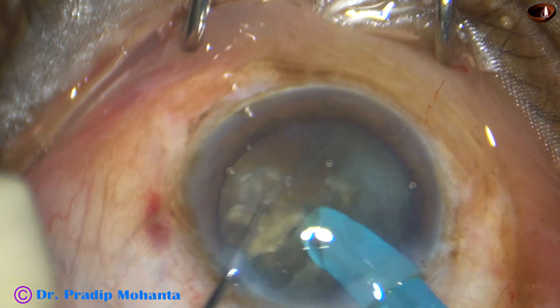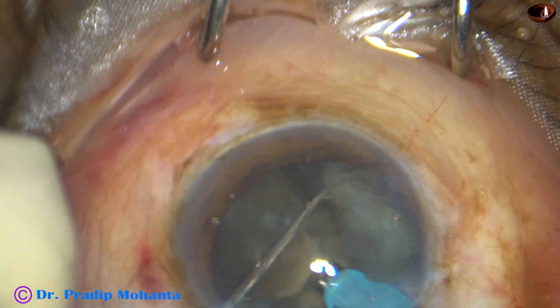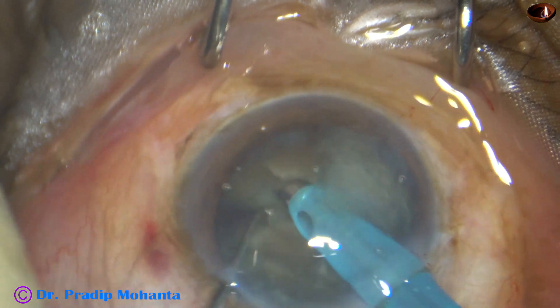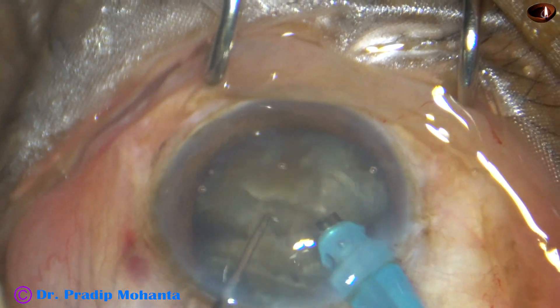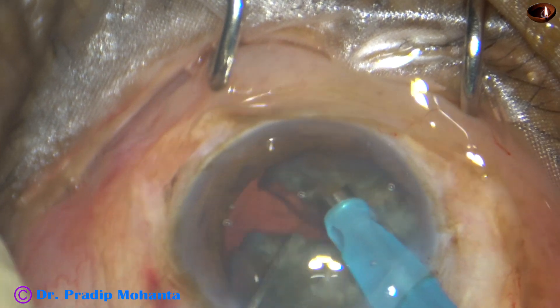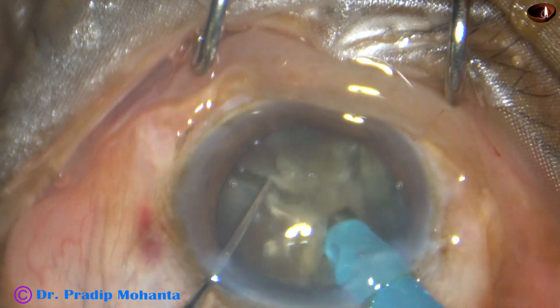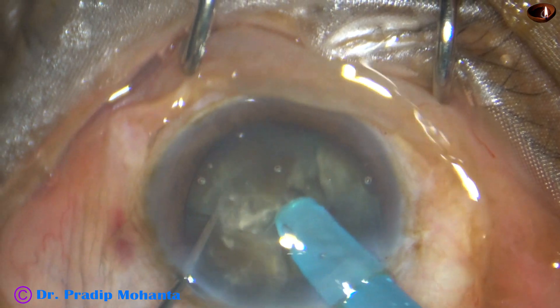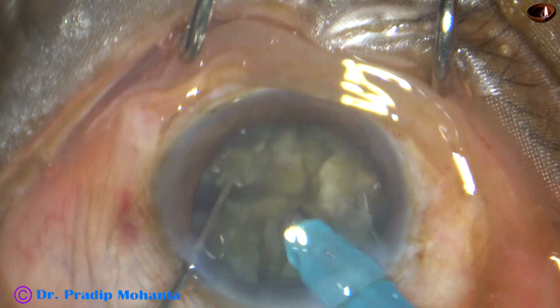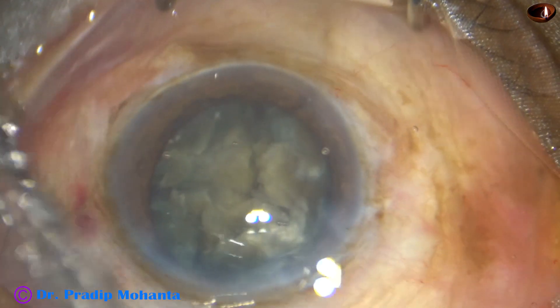This is a nice crack. Another chop on the hemi-nucleus. Now I am trying to separate the two hemi-nuclei — but see what has happened: the pieces are not free. They are joined to each other by leathery bands. I attempted again to separate these pieces and sculpted some more to make the posterior plate thin, but could not.